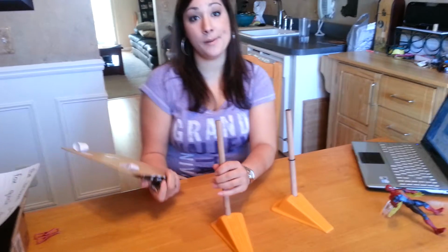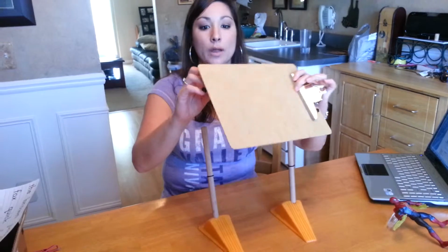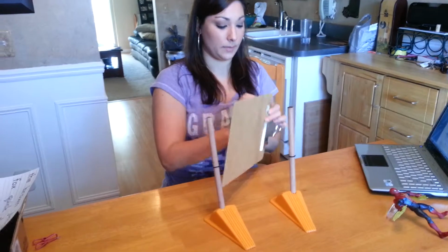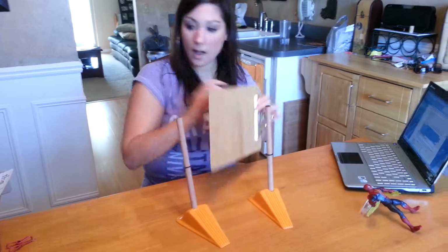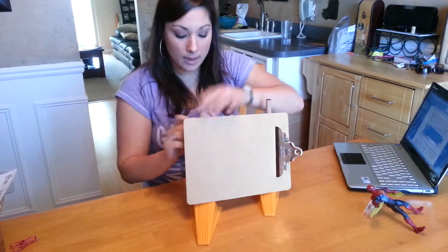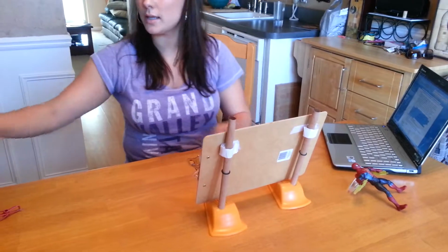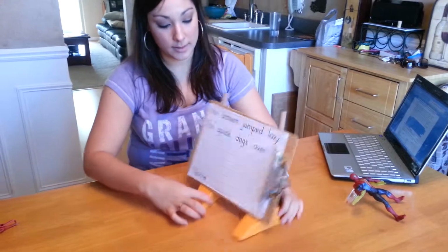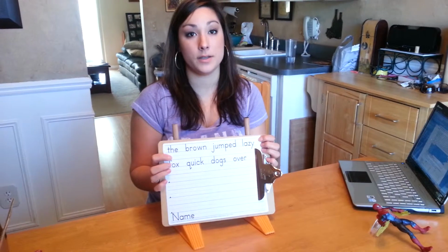So I wanted to try to make it adjustable in order to adapt it for the kid. I would probably primarily make it for one specific child, but this way you can adapt it. Since visual perception was something we read a lot about this past week, that was on my mind, and putting it up more in the line of vision for the child, they have easier visual attention to it because it is so close, and it's eliminating any other stimulus. This is part of the assessment for the Minnesota handwriting assessment, but this puts up the words right in the line of vision for the child.